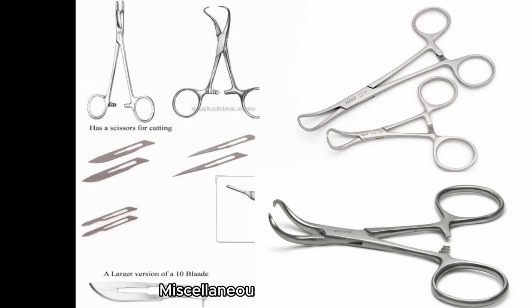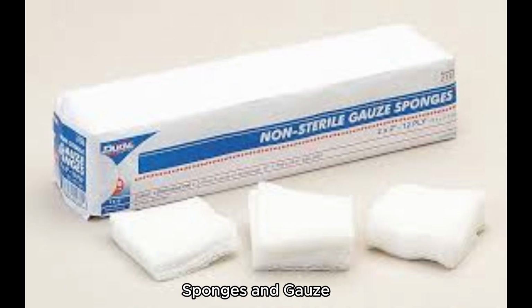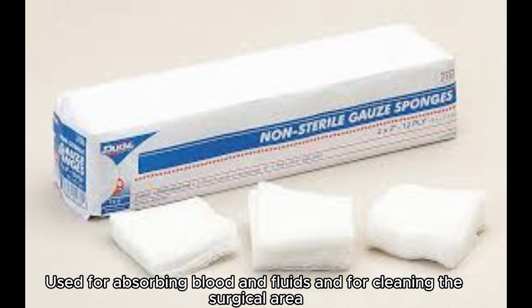Miscellaneous instruments. Towel clamps, used to secure drapes and towels to the patient's skin. Sponges and gauze, used for absorbing blood and fluids and for cleaning the surgical area.